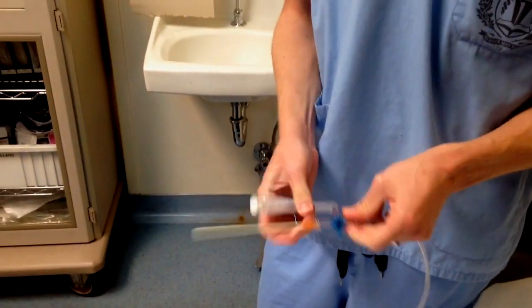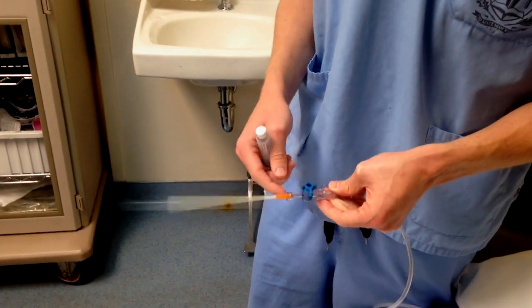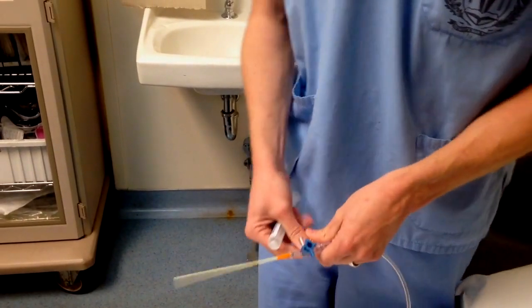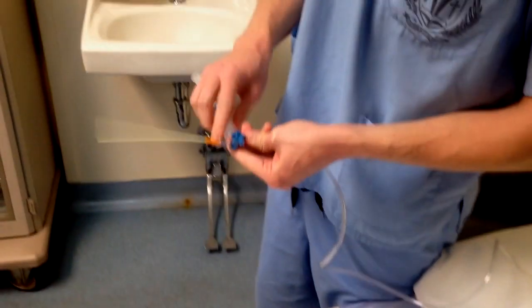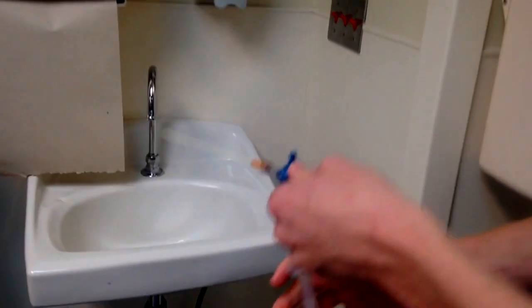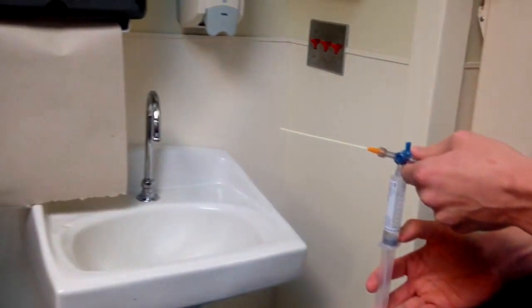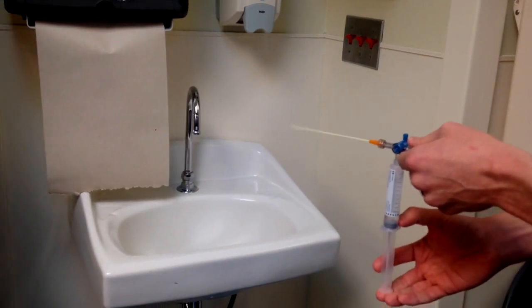We just have saline here, but we would use 4% lidocaine. I've hooked up the angiocath on one end, and I'm going to put the saline flush on the bottom port. It's best to hold it straight up and down because the air is going to try to go in that direction. I'm going to atomize onto this paper towel.